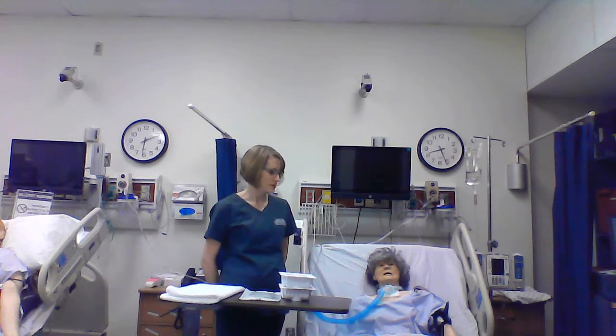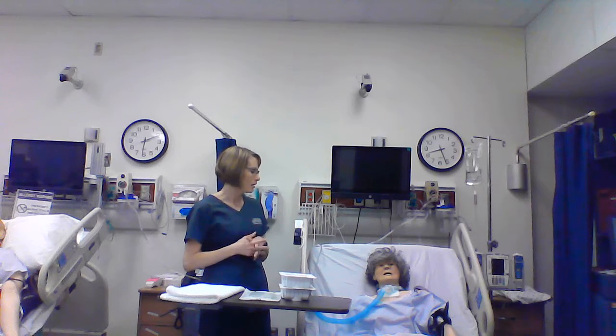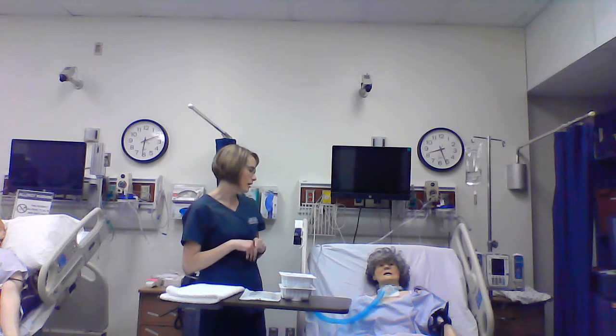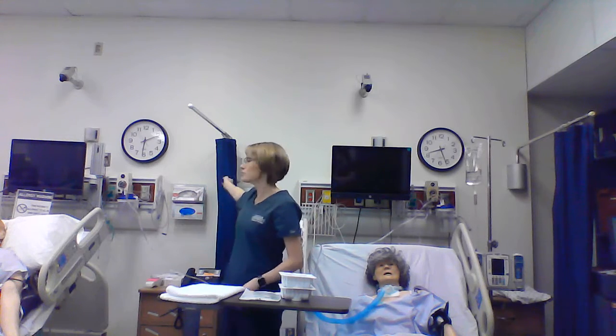So what I would do first, you want to do trach care at least once a shift or every 8 hours. You want to come in and introduce yourself to the patient, get their name and date of birth, and verify that with their armband. Make sure you have the correct patient. Obviously, your patient would have a trach. Provide privacy for your patient, so pull their curtain.